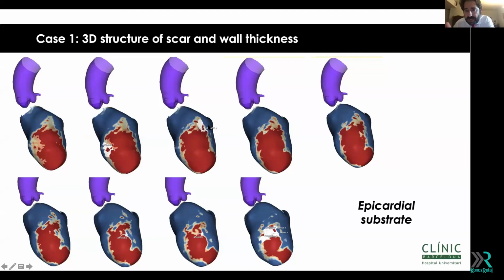30%, so still in the endo, I would say, a small channel here, but look here in the epi, in the 90%. So this was an ischemic patient with a huge scar, very dense in the endo, but with clear channels in the epi.